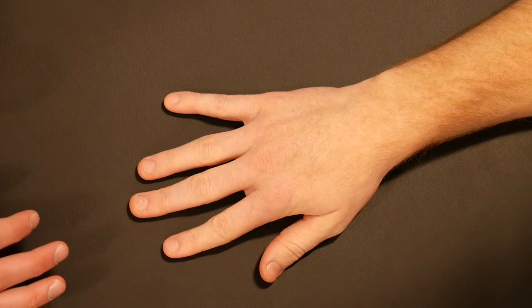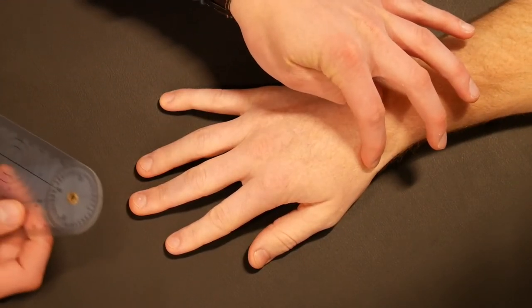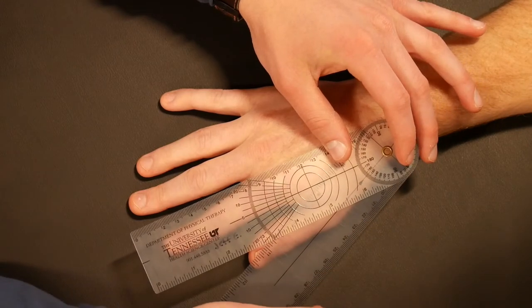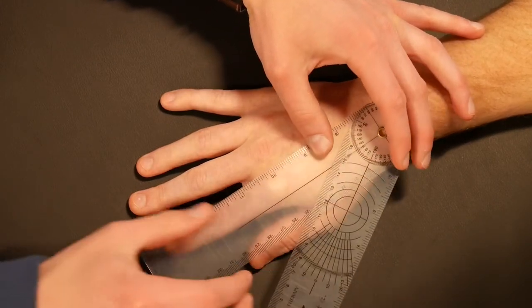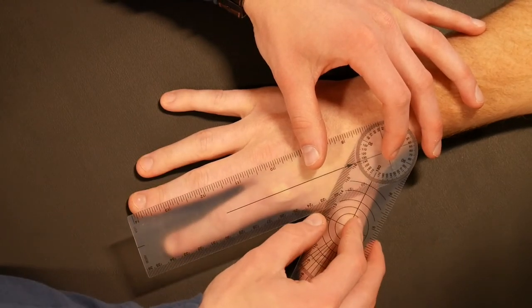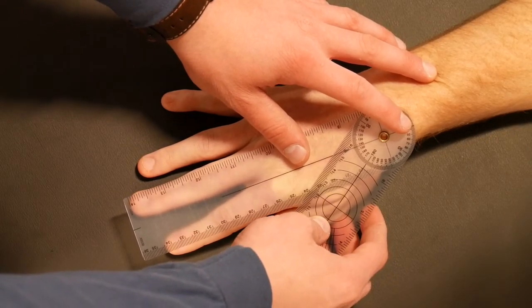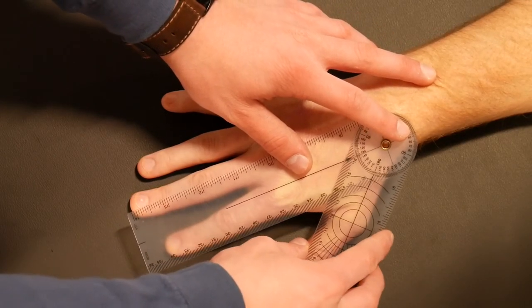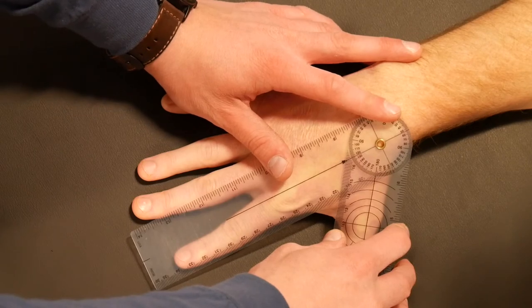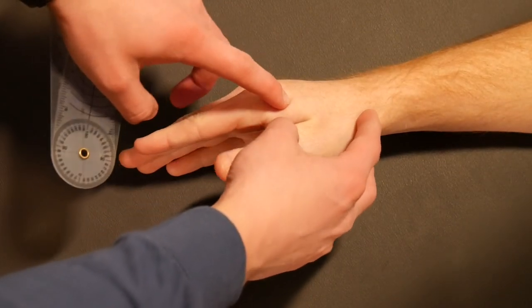Now we'll cover CMC range of motion, starting with CMC radial abduction, which is probably the most commonly measured. Locate the CMC joint and set the axis of the goniometer right over it. The stationary arm goes over the dorsal aspect of the second metacarpal in line with that bone, and the moving arm is in line with the dorsal aspect of the first metacarpal. Start with the patient in a relaxed, thumb-loose position, then have them actively abduct the thumb away from the radius — hence radial abduction. In this case we have 50 degrees of radial abduction.